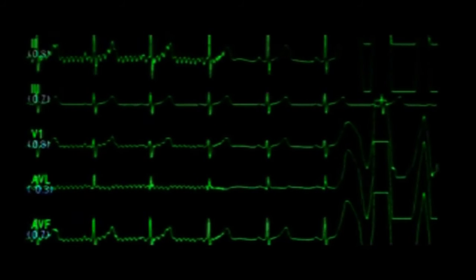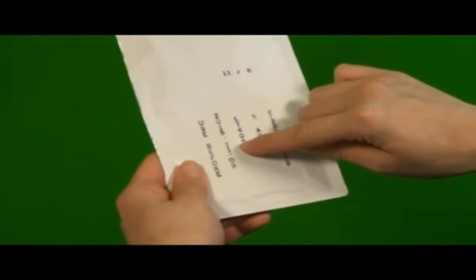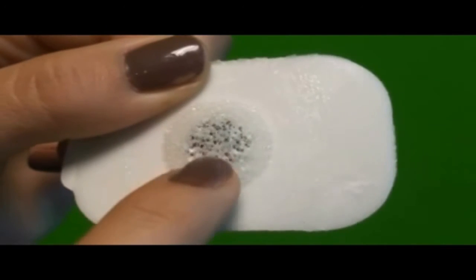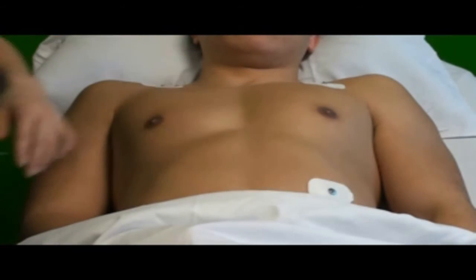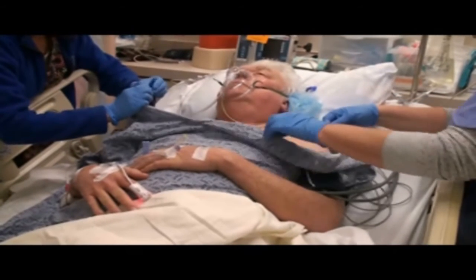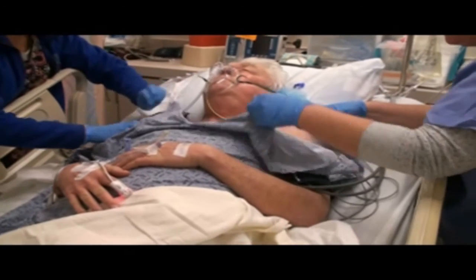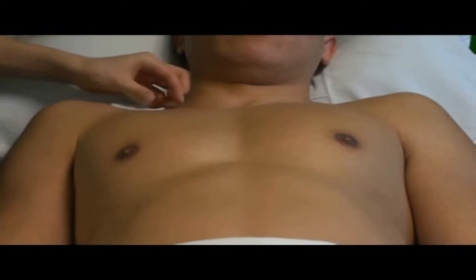To avoid the problem of artifacts or poor quality tracings, make sure that the electrodes have not expired, that conduction gel has not become desiccated, and that the electrodes have adequate contact with the skin. Check and adjust placement of the leads. Adjust the amplitude on the monitor as needed. Patient motion can also cause artifacts. To minimize the occurrence of artifacts, place the electrodes on areas where there is minimal muscle movement, such as on the torso near the limbs, rather than on the limbs themselves.